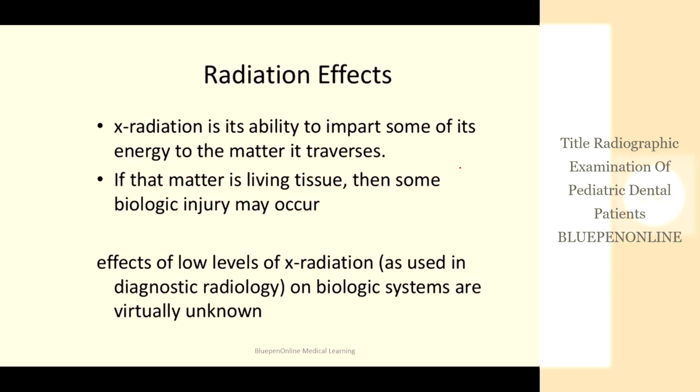Coming to radiation effects, we know that X-rays are ionizing radiation. So the X-ray radiation has the ability to impart some of its energy to the matter it traverses. If that matter is living tissue, then some biological injury may occur. The effects of low levels of radiation on biological systems are virtually unknown.